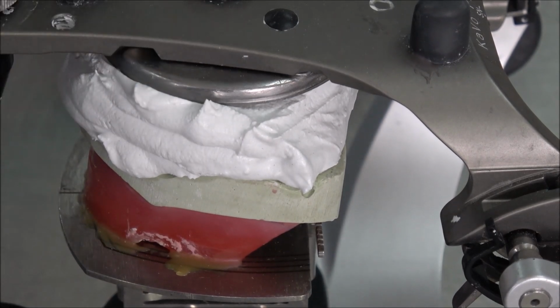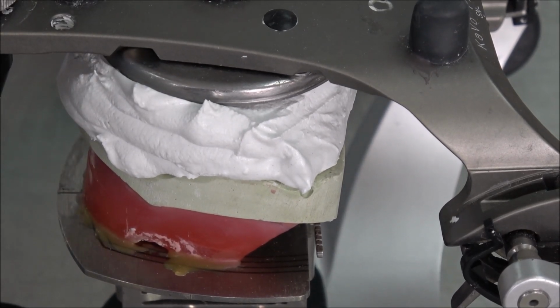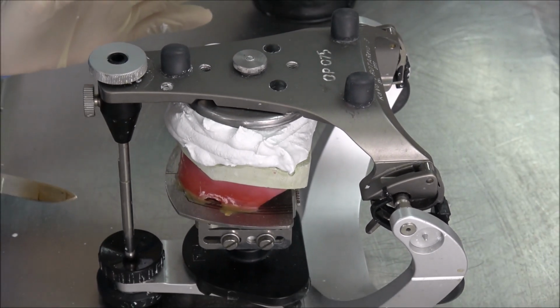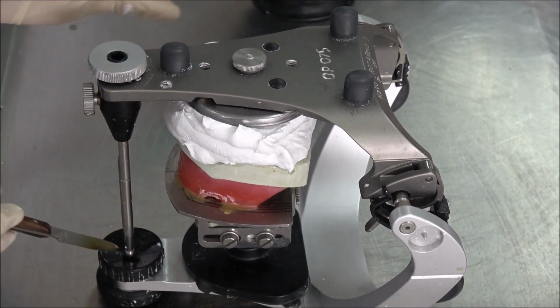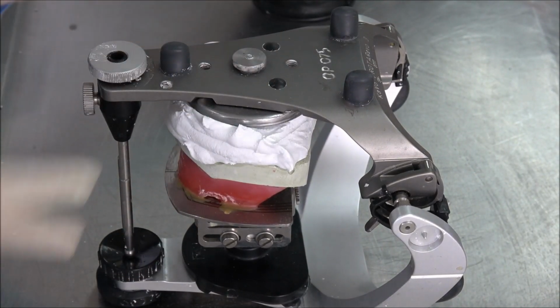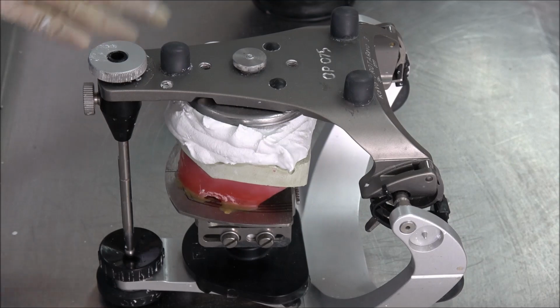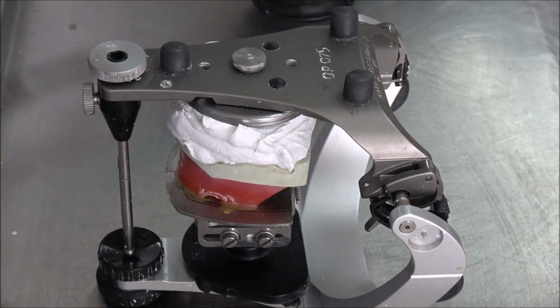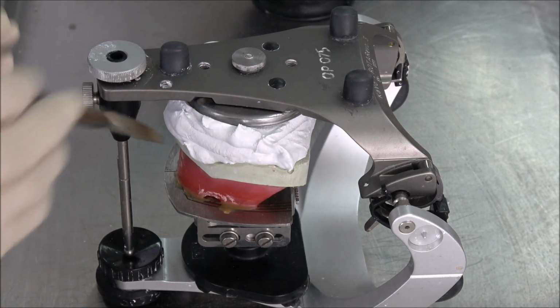When we remove it, please don't move our articulator. Make sure it doesn't open, make sure it sits properly, and then make sure we just remove the excess. Don't keep turning it. Many students are good at turning it around. Make sure don't turn it. We just leave it and only use our wax knife.